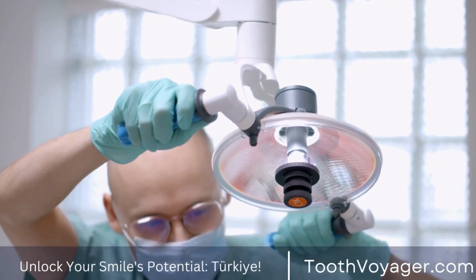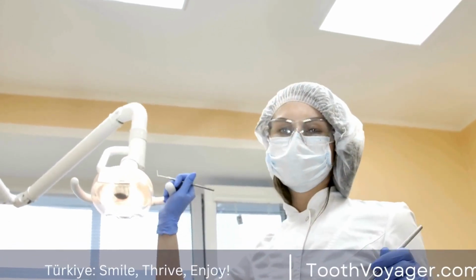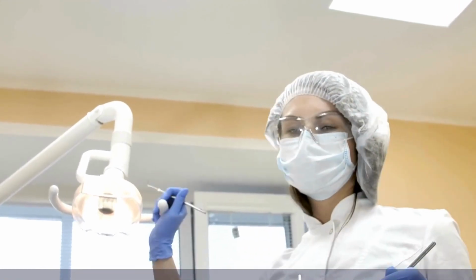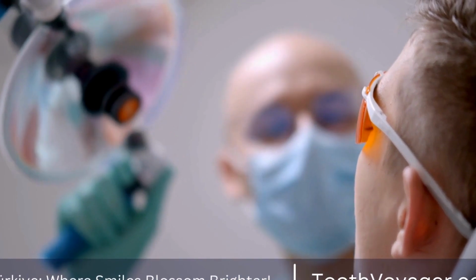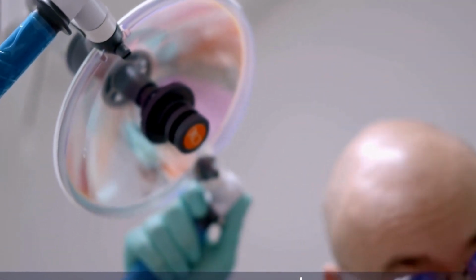2. Treatment planning. When it is determined that the patient is appropriate for dental implants, the dentist develops a treatment plan specifically tailored to each patient's needs. The treatment plan will detail the required number of implants as well as the place of the implants and any other procedures that could need to be completed before the implants can be put in.